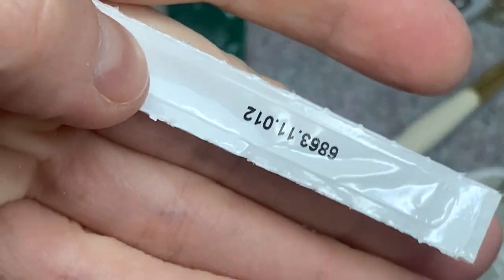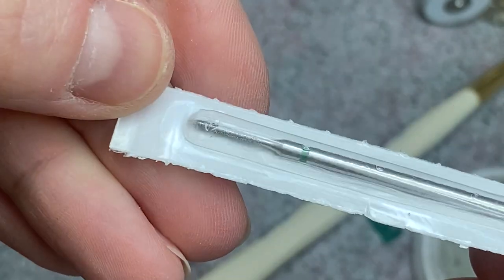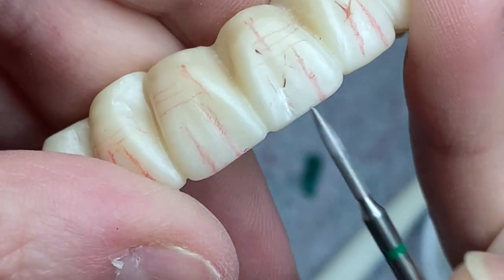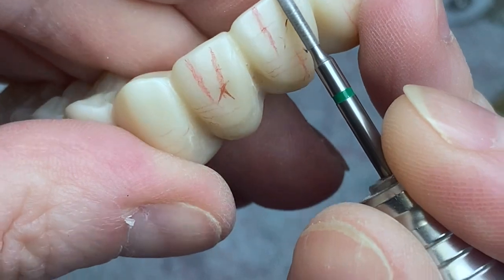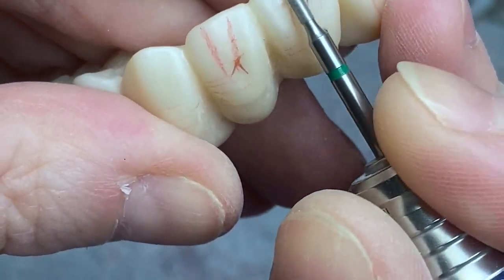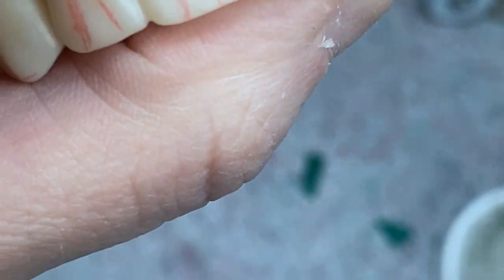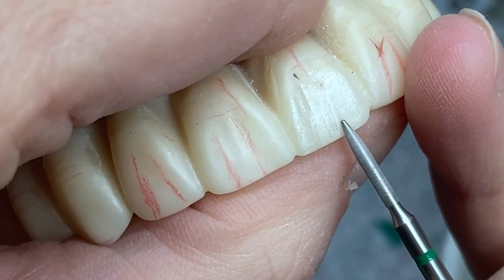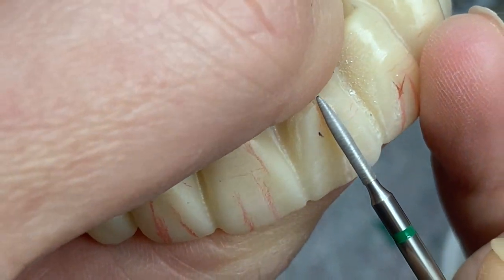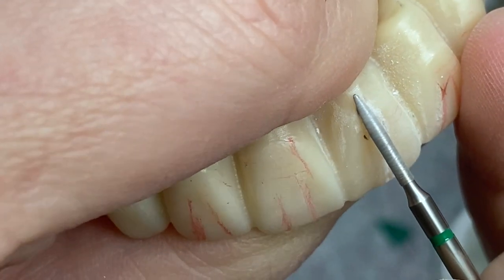So at first I'm gonna be using this burr — this is the burr's number if you want to order it, that's what it looks like. Ideally, of course, it'd be better if all this grinding is done when it's still in the soft stage before it was fired. If you want to make any prominent lines, you can put your burr on a low speed like 15, that way it would be much easier for you to control it while it's grinding.